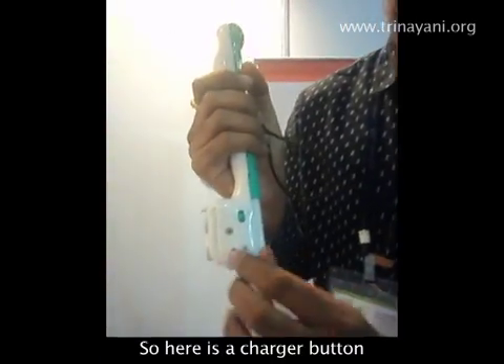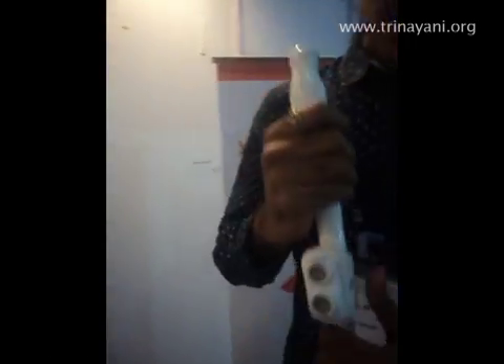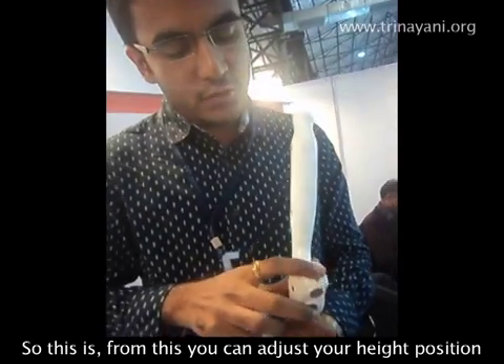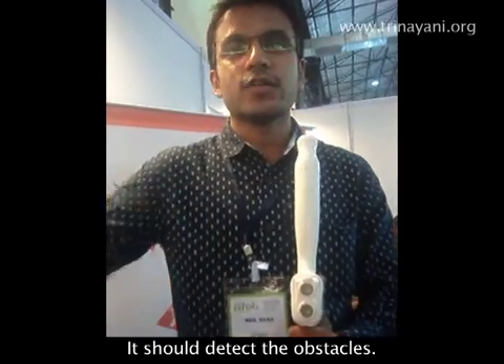Here is the charger slot from which you can charge the device. From this adjustment you can set the device according to your height position, and you can also adjust the angle at which you want to detect the obstacles.